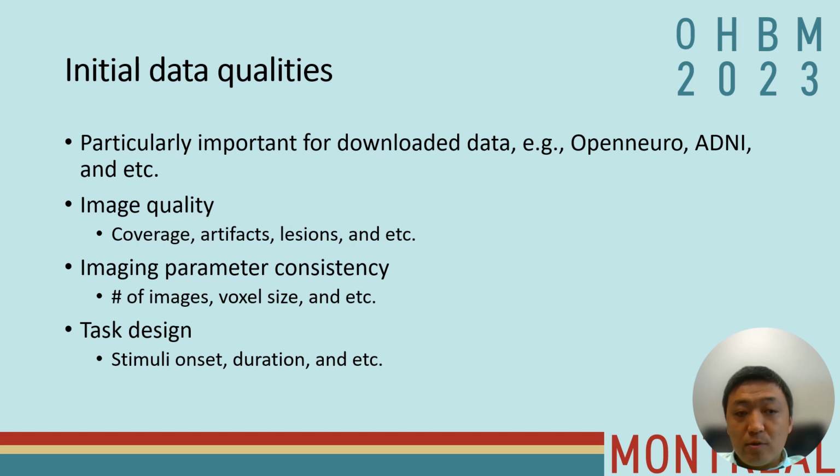Performing initial data quality control is usually overlooked, but it becomes more and more important when you analyze data from online sources, for example, OpenNeuro or ADNI. It is really important to check the data quality before you perform any of the data analysis on those datasets.